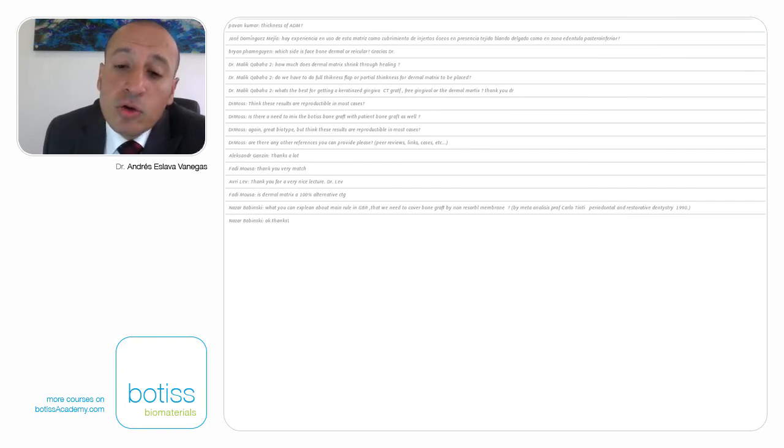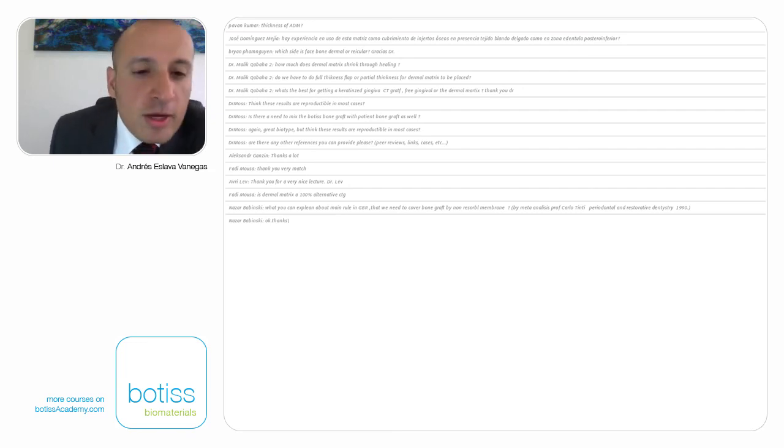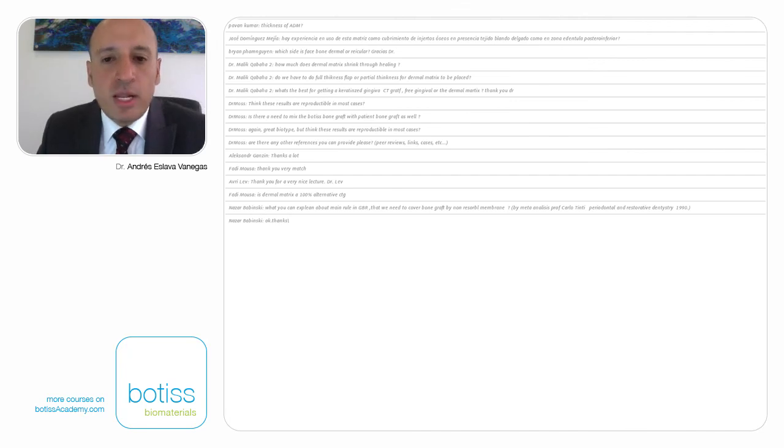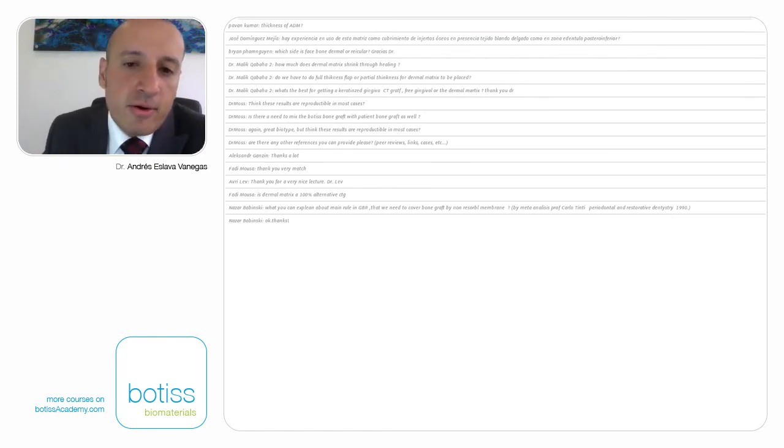Now, getting back to your question, I think that the free gingival graft could be a better approach to get keratinized tissue. Dr. Moss has 3 or 4 questions. The first one is, do I think these results are reproducible in most cases? Yes, of course, but the dermal matrix graft has a learning curve. You have to do hands-on, you have to do workshops, you have to train a lot before you start to work with this kind of material, because it's too thick. When you soak it in saline solution or in growth factor, it's going to grow about 25%, so it's really difficult to handle. But if you have the experience, every day is getting better. So is it reproducible? Yes, of course, if you choose the patient right.